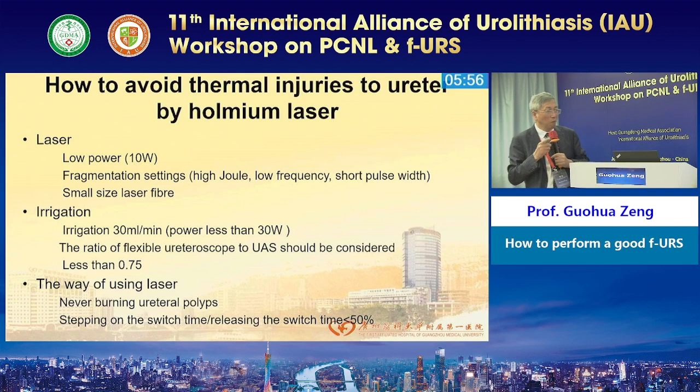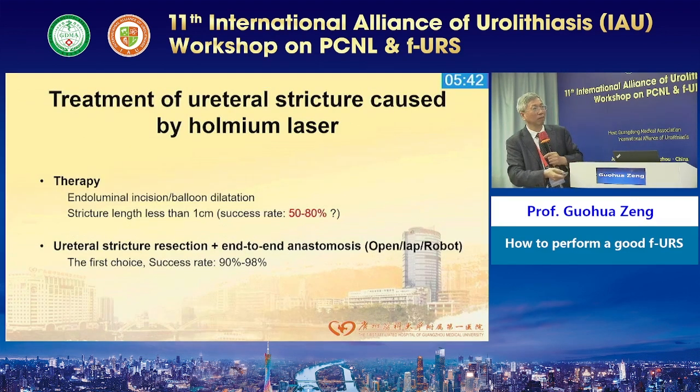And the holmium laser on the ureter wall, do not do it. If you do it, maybe you injure the mucosa of the ureter and cause stricture. And sometimes this stricture is caused by this laser.